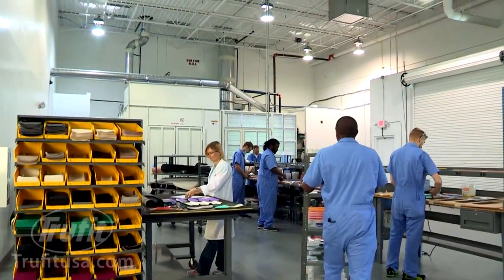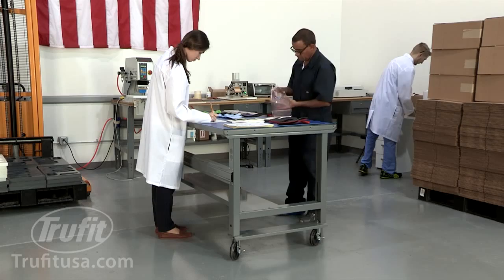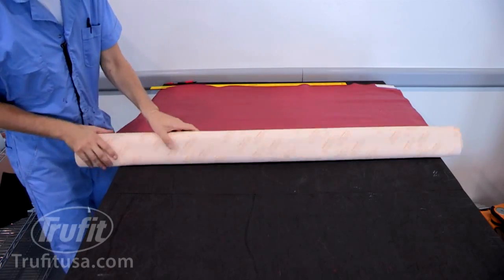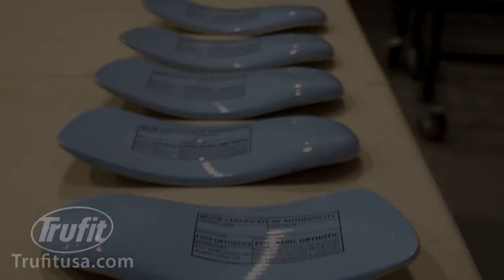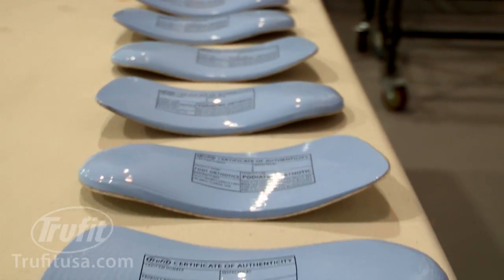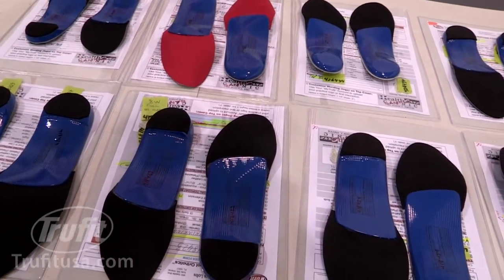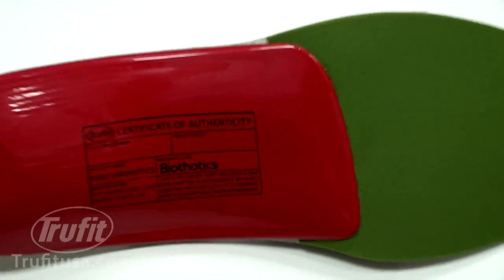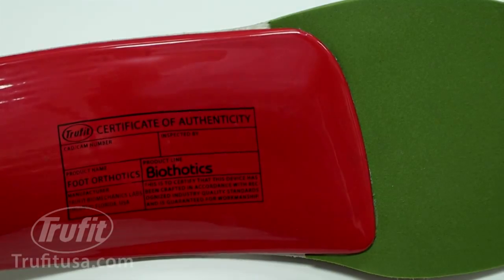In the final assembly laboratory, various modifications and accommodations are applied to the orthotic. All of the materials used are specially sourced for podiatric care. Authenticity stamps are applied after a final quality control and inspection is completed, confirming the authenticity and uniqueness of each product.